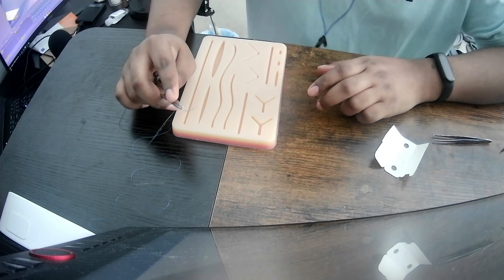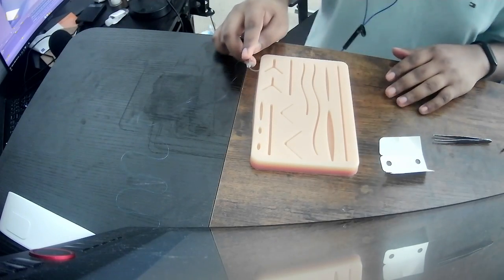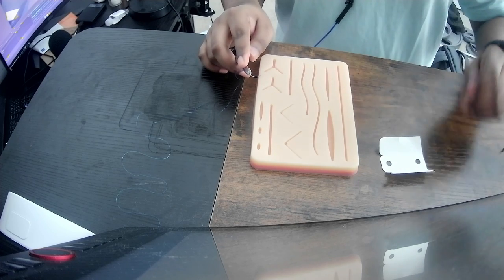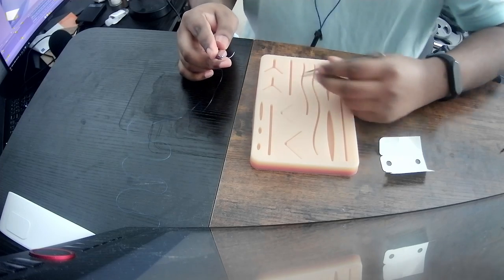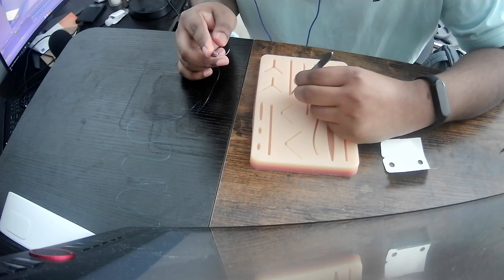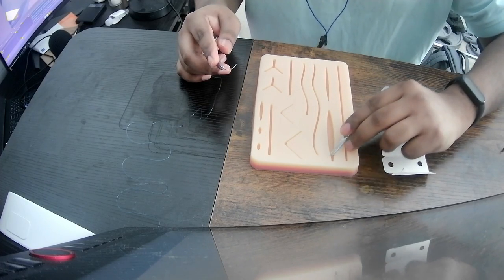We know how to load our needle driver here, and we have everything ready to go. Again, with our forceps, we're mindful of where the teeth are because we're going to be using this to manipulate things. And we've loaded the needle more or less perpendicular in the middle because the bites we're taking aren't too large here.